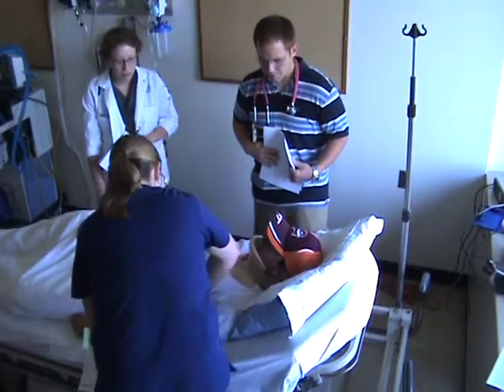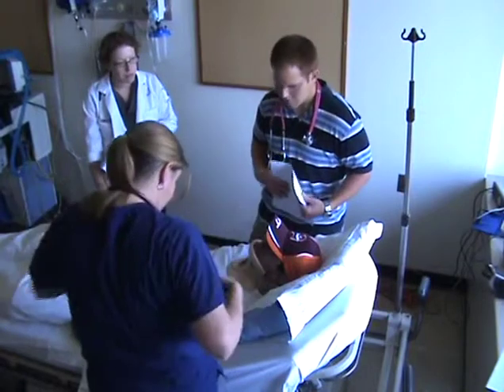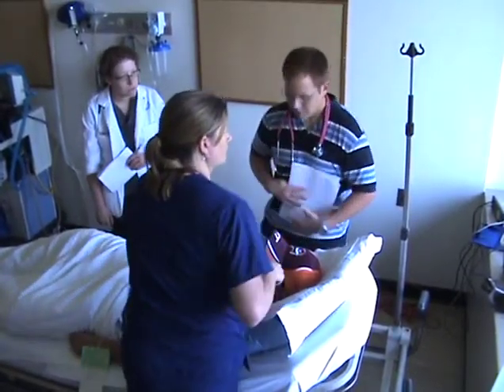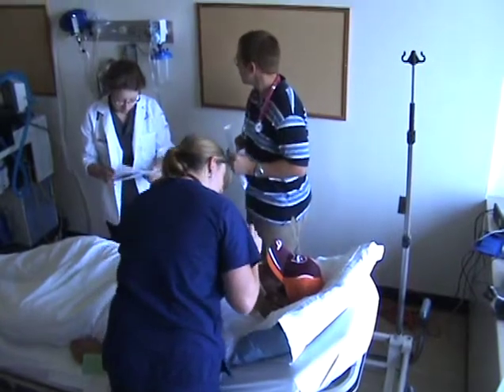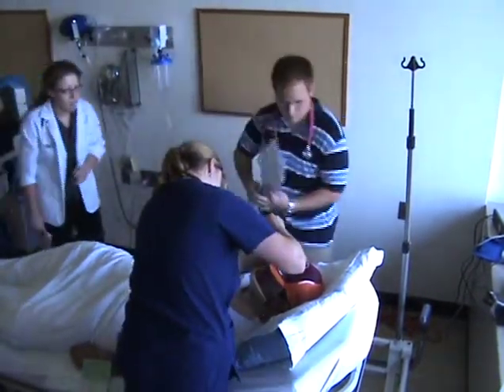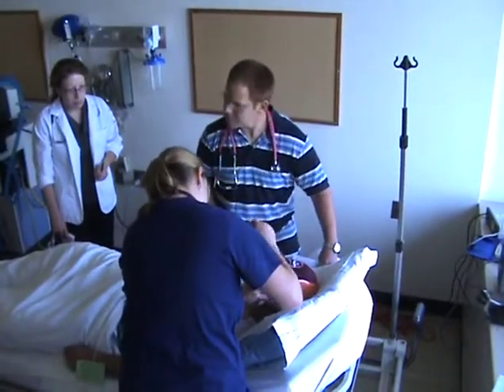Is the airway open? You look in the airway, and he has vomit in his mouth. Okay, I'm going to suction the airway. And what about breathing? Can you open your mouth for me? Okay. And you see vomit in there. Okay, suctioning. That clears the airway.